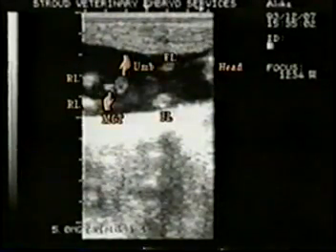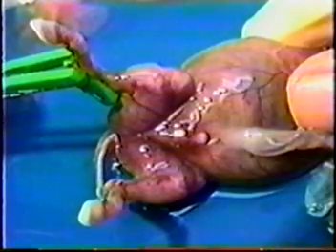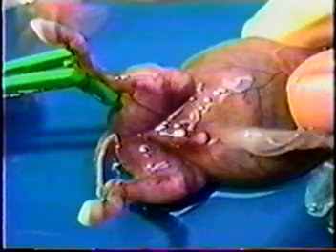Note the labeled structures with particular emphasis on the umbilicus and just caudal to it, the bilobed male genital tubercle. This is a 70-day male fetus in the same position as the previous ultrasound frame. This is a real-time cross-section view of the same 70-day male.